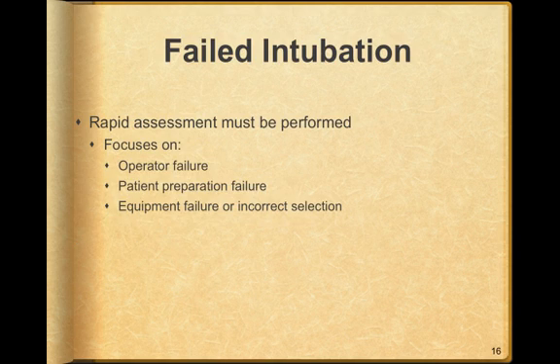A failed intubation. Rapid assessment must be performed if we fail an intubation. This should focus on the operator themselves failing, patient preparation failure, we didn't get prepared enough, or equipment failure or incorrect selection.